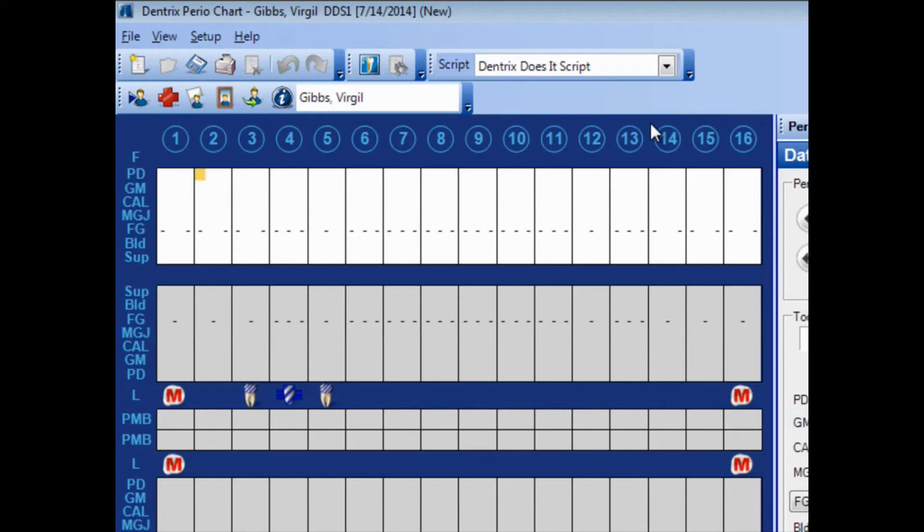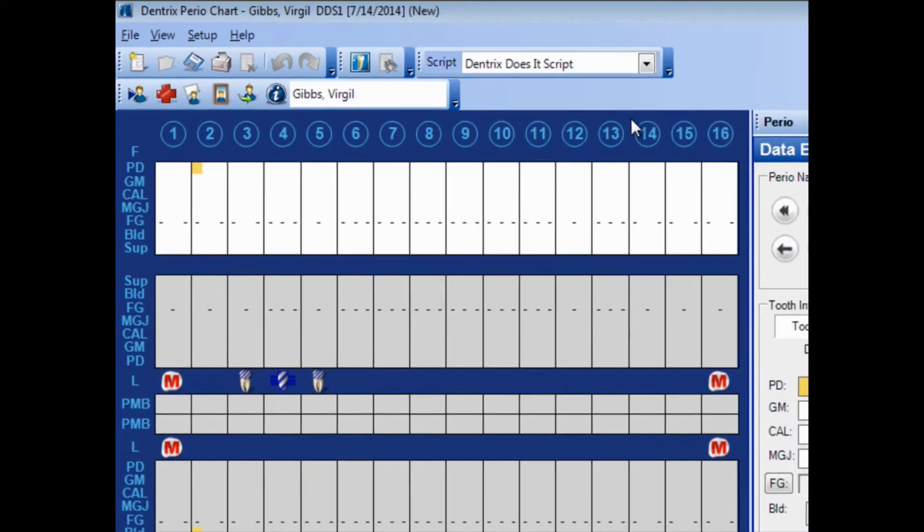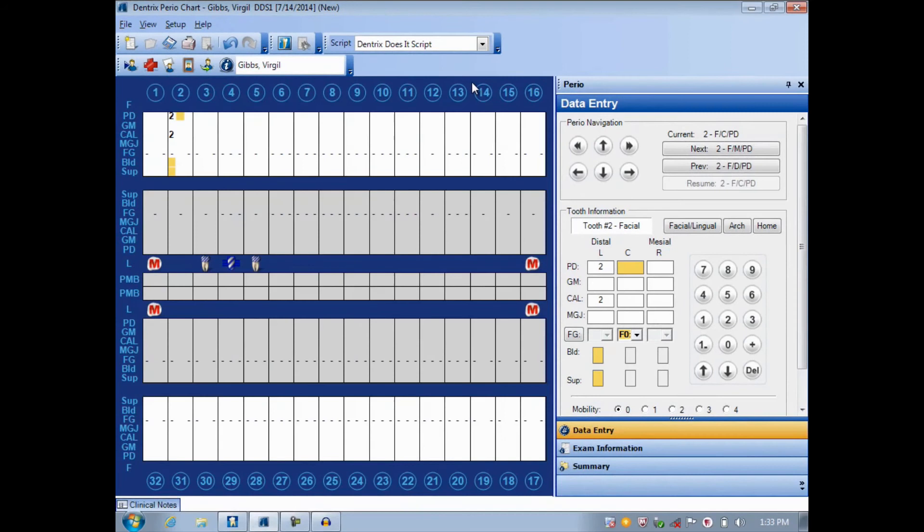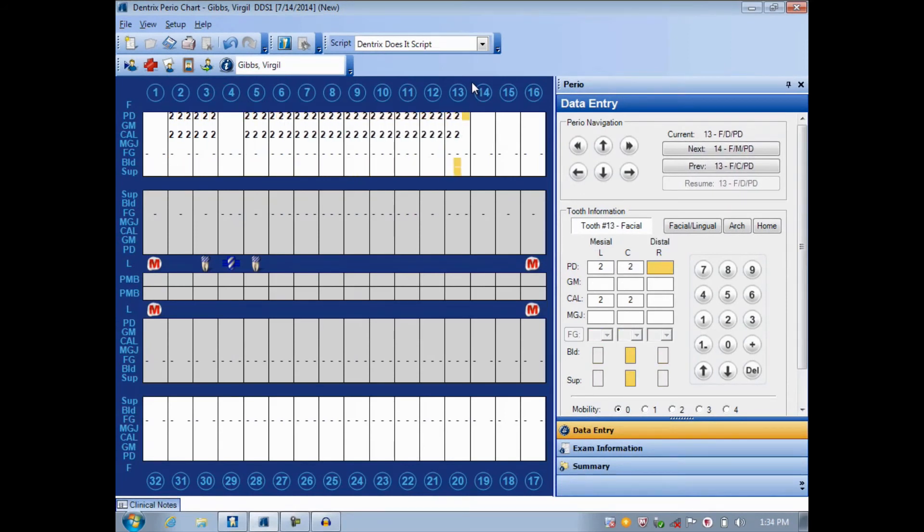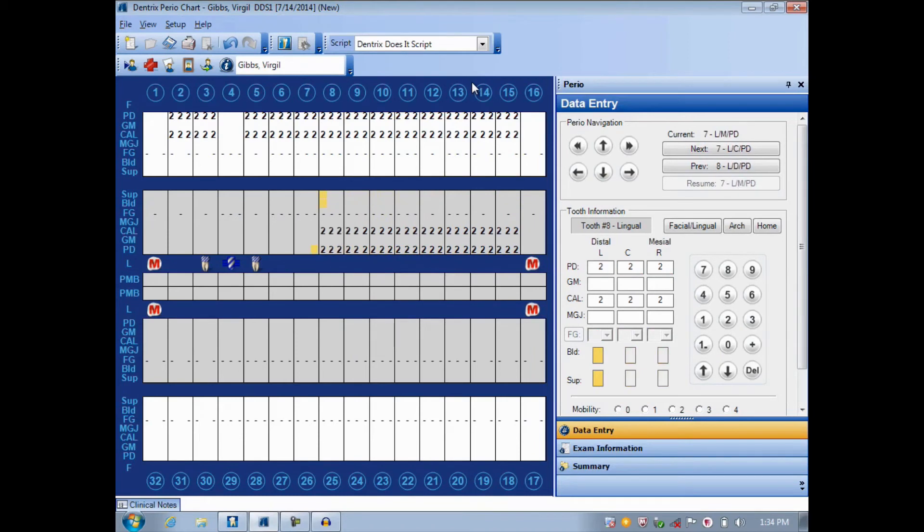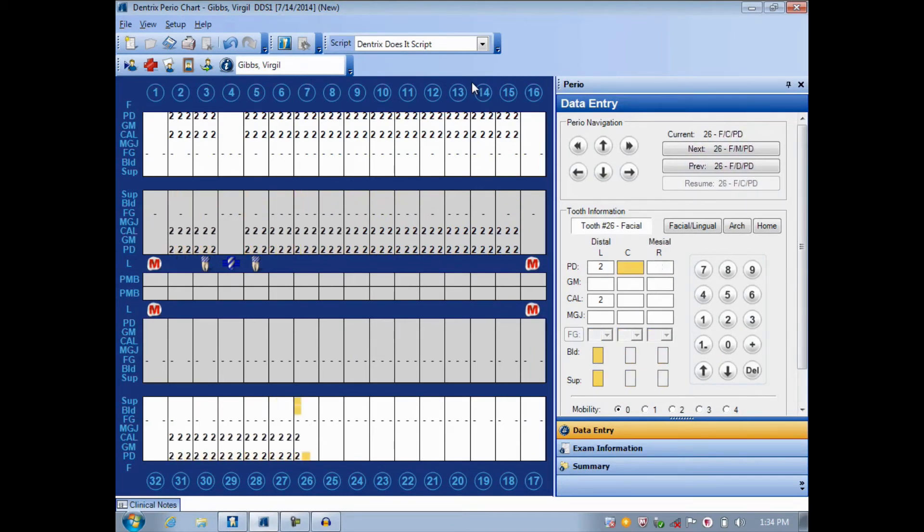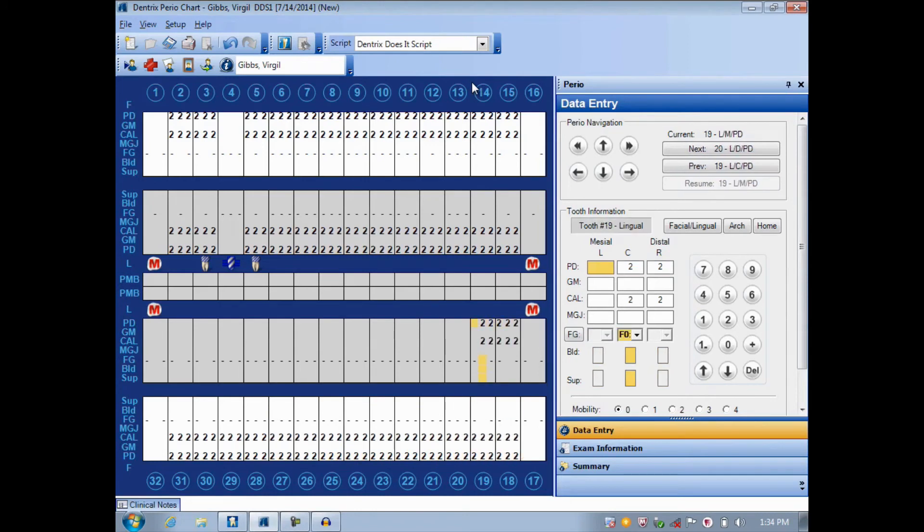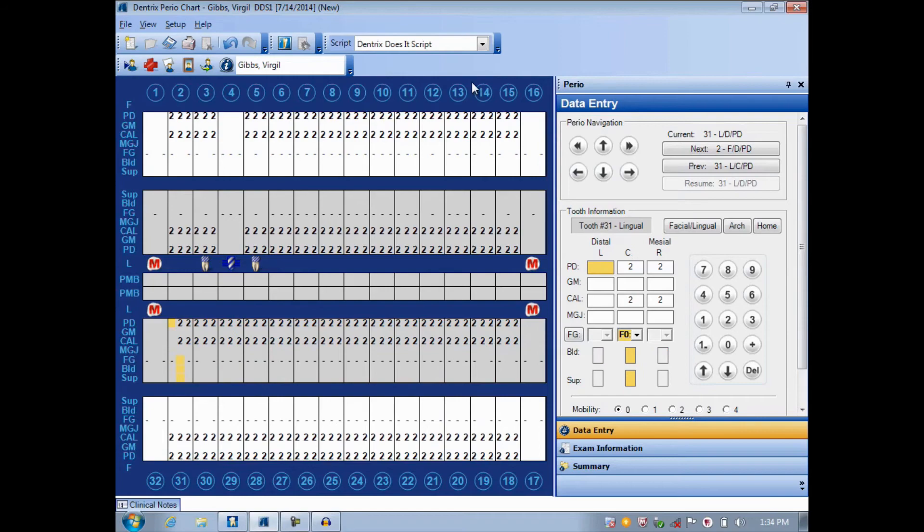At this point, I'm able to enter probing depths. And just for the sake of time, I'll enter some numbers quickly to make sure that it moves in the correct direction. And notice it skipped over tooth 1, 4, and 16. And 32 is also skipped. And 17 is also skipped. That's because those are missing teeth or they're part of a bridge.